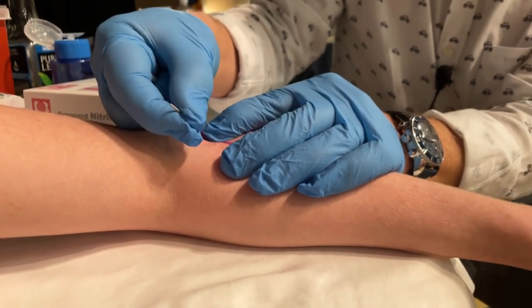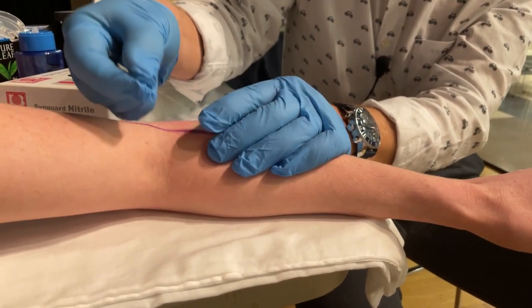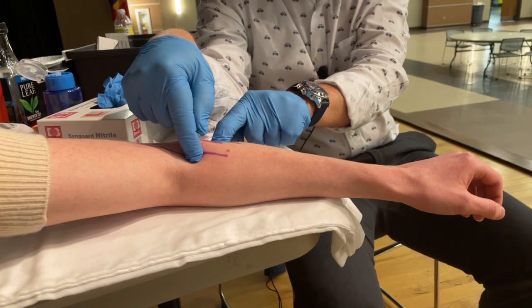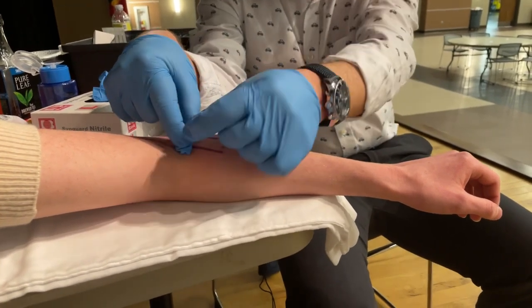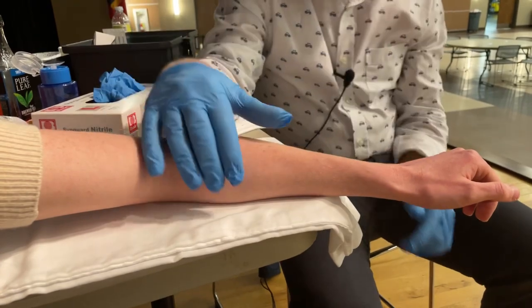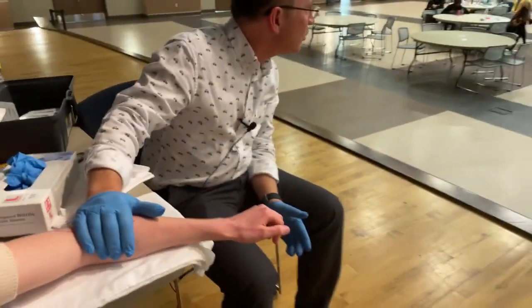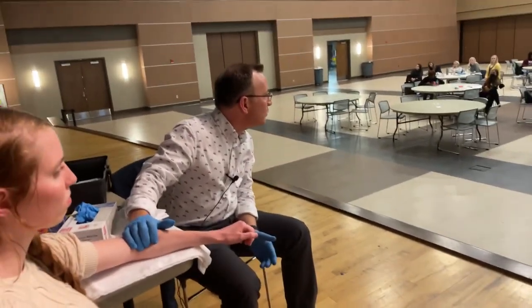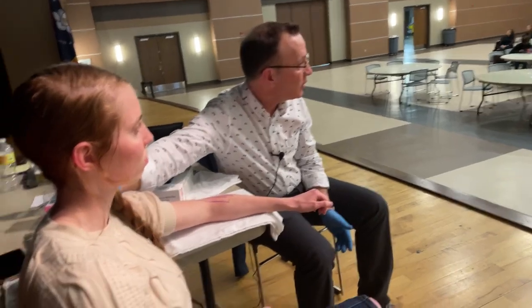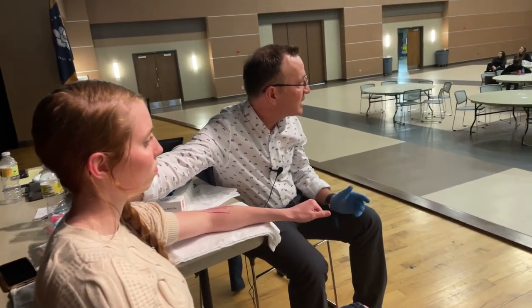There went a little twitch — you felt a little soreness? Right there in the brachioradialis. In and out several times, and I could leave that needle in, go to another muscle, needle that, then another muscle, and connect them with e-stem and run that for 15 minutes. If she was reporting a lot of tenderness at her elbow but I didn't get many trigger points locally, I'd be looking at what might be sending that pain signal down to the elbow.